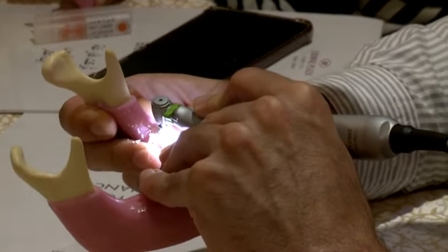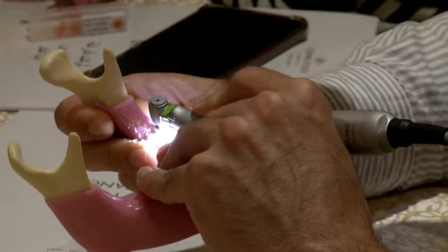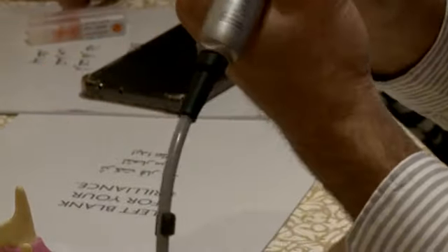When we do this with a full thickness flap elevation, trying to preserve the keratinized mucosa, we displace that keratinized mucosa to the buccal side. And this is not sped up or anything, this is real time, so that way you can see the time that it takes to do the surgery.